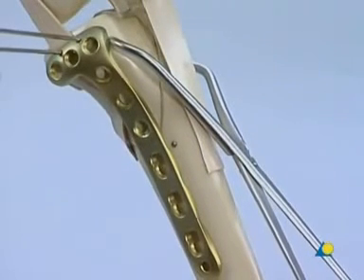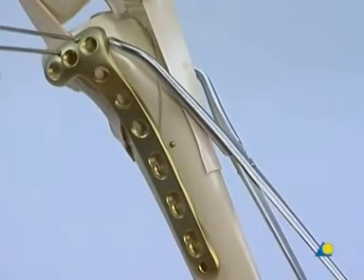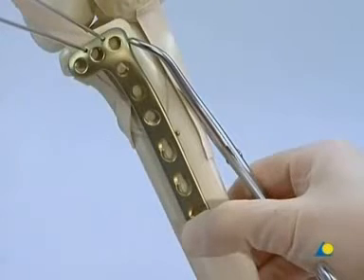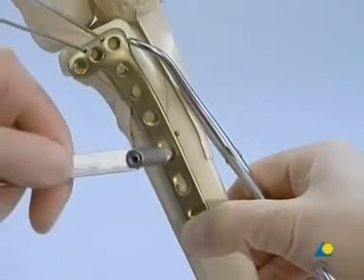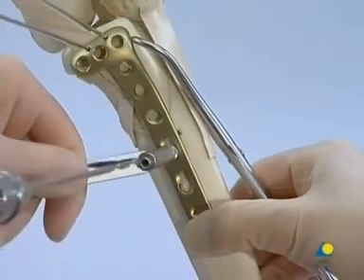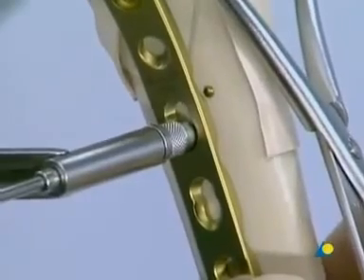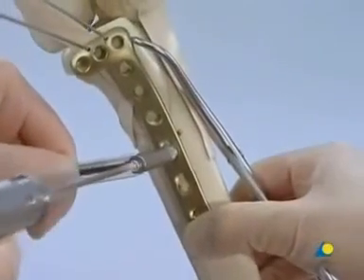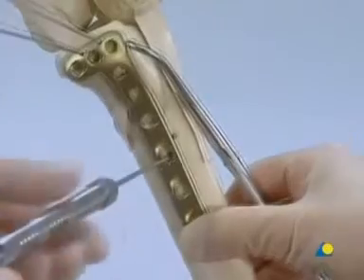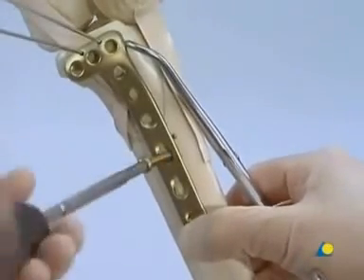Before placing any screws, it's advisable to check the quality of the reduction with X-rays in 2 planes. The first screw is inserted through the plate hole, just distal to the apex of the fracture. The 4.5/3.2 universal drill guide is used in the neutral position. Both cortices are drilled through, using the 3.2 millimeter drill. After measuring and tapping, the 4.5 millimeter cortex screw is inserted.